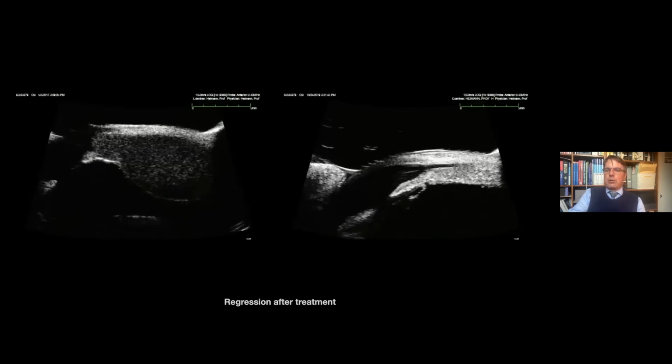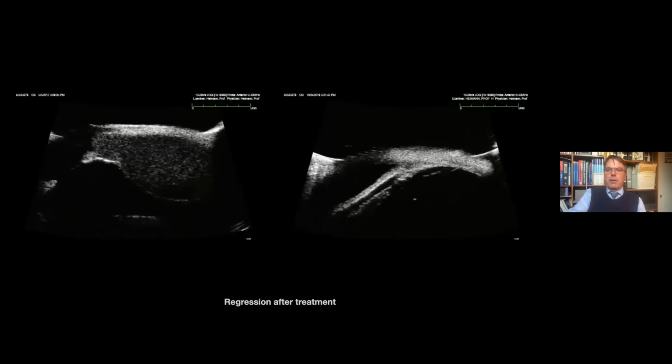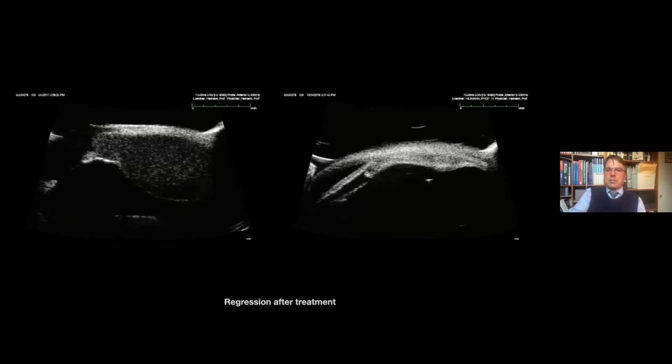This is the hidden corner of the eye where we cannot see the tumor with ophthalmoscopy or wide angle photography, and we only have the ultrasound. And this is the high resolution anterior segment ultrasound to watch these lesions. So we need to perform that in every case. This is why, unfortunately, some patients do need to come to us on a regular basis, because this anterior high resolution ultrasound is not available everywhere. And if we have a tumor in front of the eye, the ciliary body, we cannot see it from the outside. The only way to really follow it is with this anterior segment ultrasound.